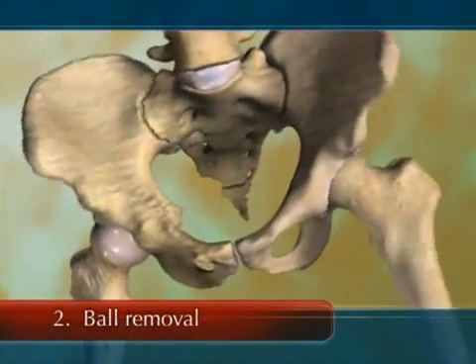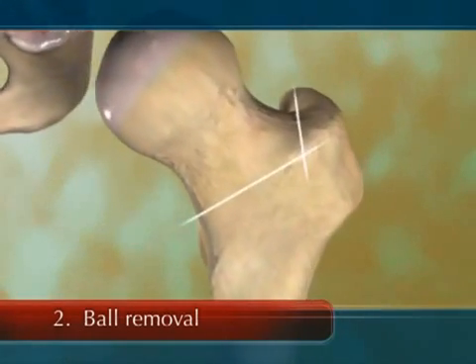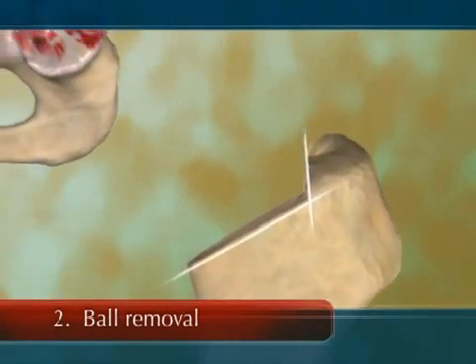Once the hip is reached, the ball is dislocated from the socket and removed from the end of the femur with a saw.